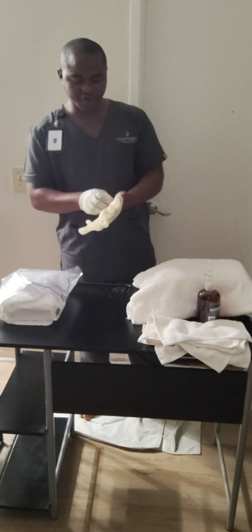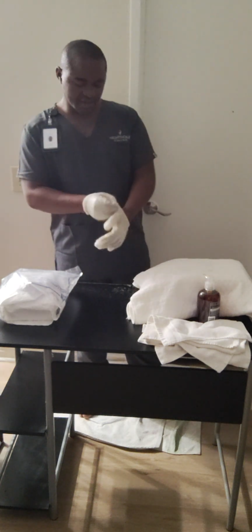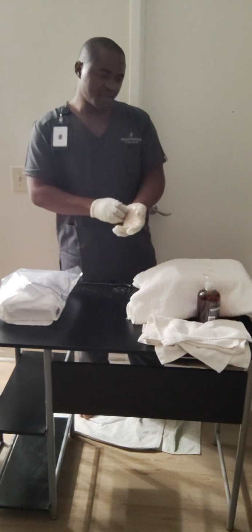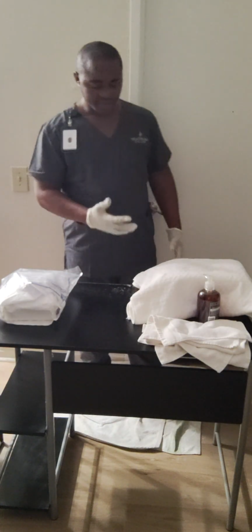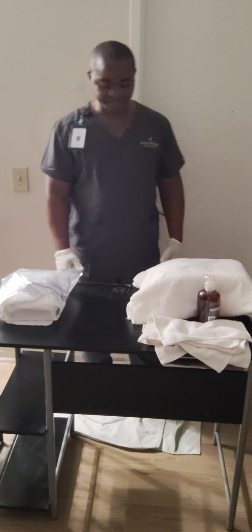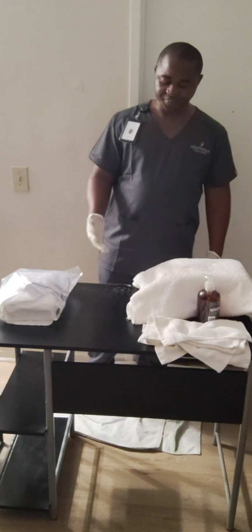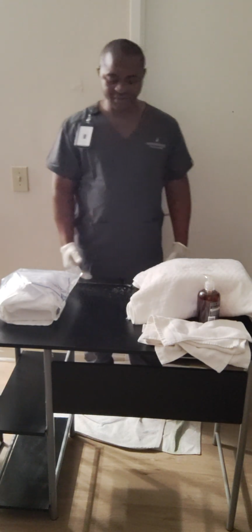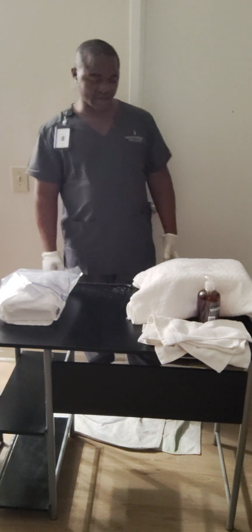Once I have my gloves on, I will then ask the patient to lift their hips up and open their legs so that we can have a good working space, ensuring that my dominant hand has access to the base of the patient. It is also important that I put a waterproof mat under the patient so that the bed does not get wet.